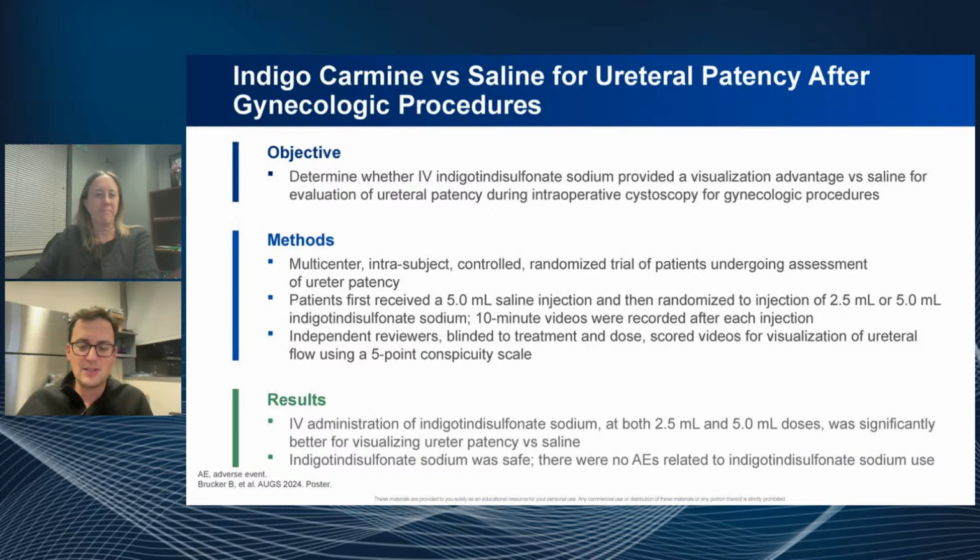It was obvious, right? This is what you knew. And so independently reviewing these videos, each patient served as their own control, and then we had some data behind the 2.5 and 5 ml. But it was very clear that the indigo carmine was more conspicuous, or a better agent, compared to just saline.